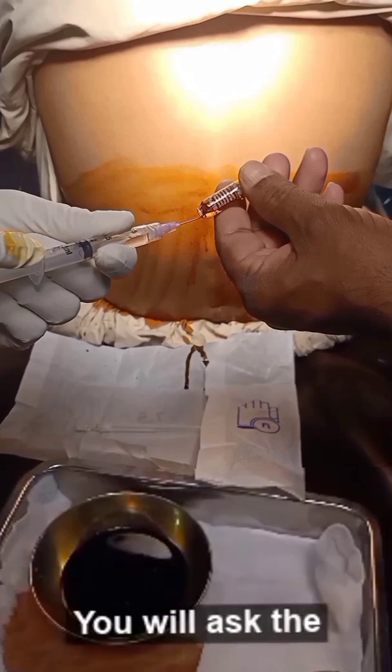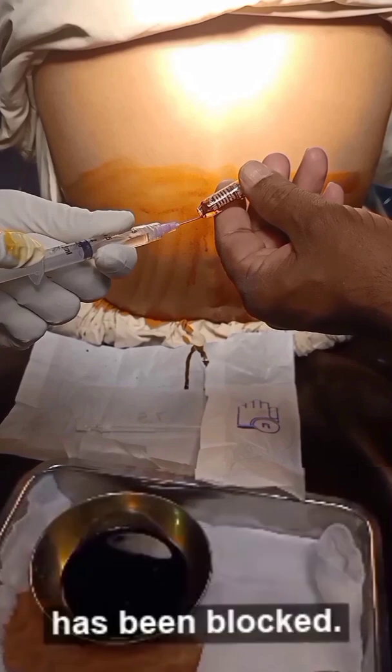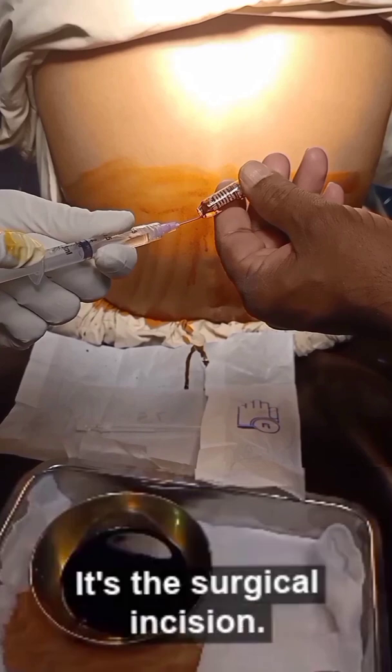In the motor system, you will ask the patient to lift the leg up — he will be unable to lift the leg as the motor system is blocked. Finally, you will check the sensory system with the help of Allis forceps, and the ideal stimulus for sensory checkup is the surgical incision.